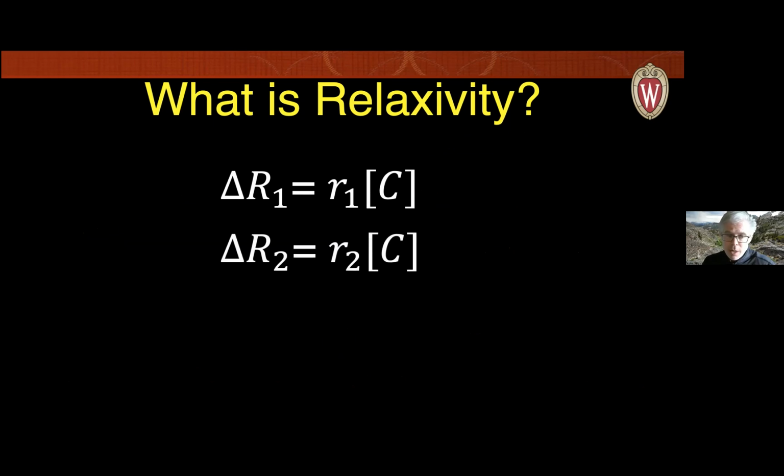You also can talk about T2 relaxivity, and you can even talk about T2 star relaxivity. So this is the amount of shortening that you get in the T2 in a spin echo weighted image, for example the middle equation, or for gradient echo acquisitions, you can talk about the little R2 star relaxivity. It's the same formulation.